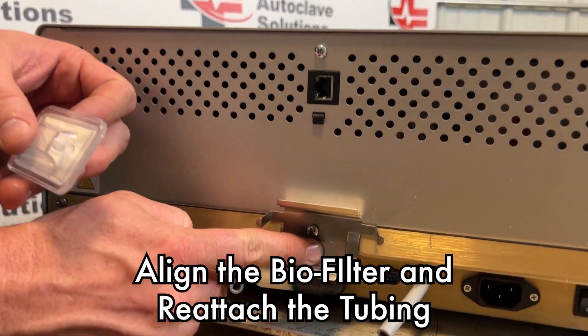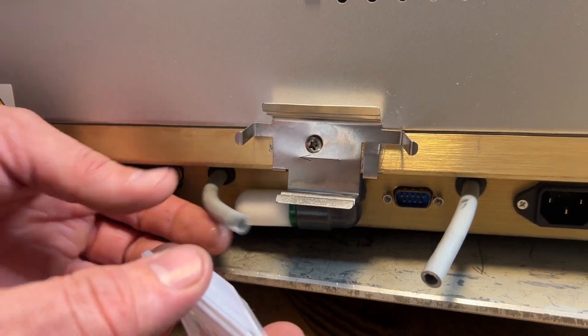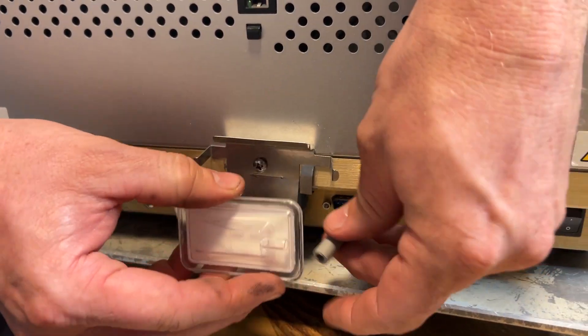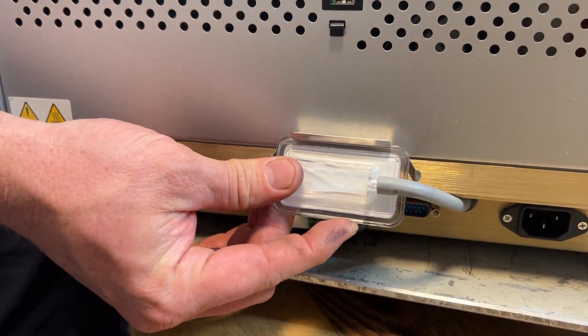If we look, we do have an arrow on our biofilter bracket as well as on our biofilter. We're going to slide that back into place, and to put this filter back into place you push up on the top and it will simply snap into place.